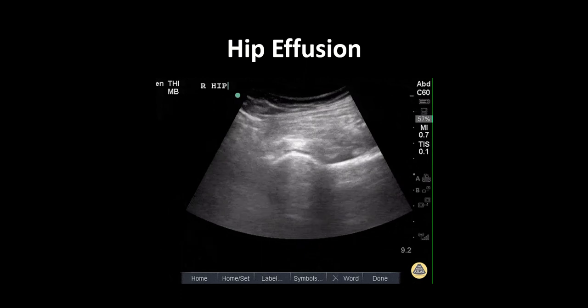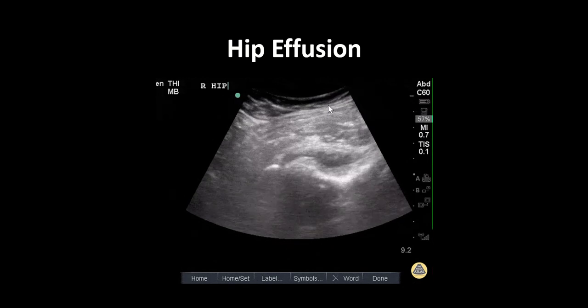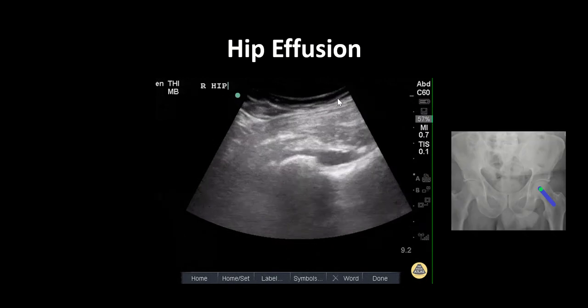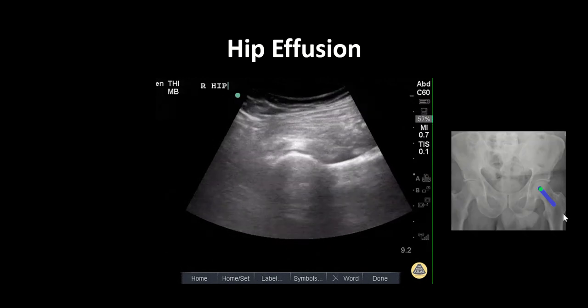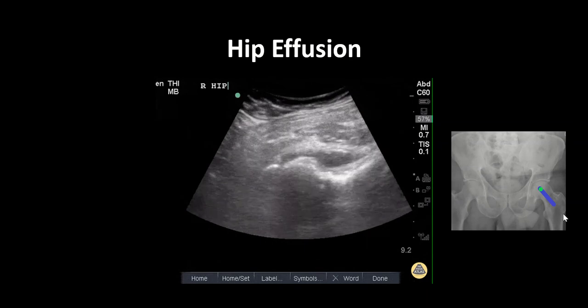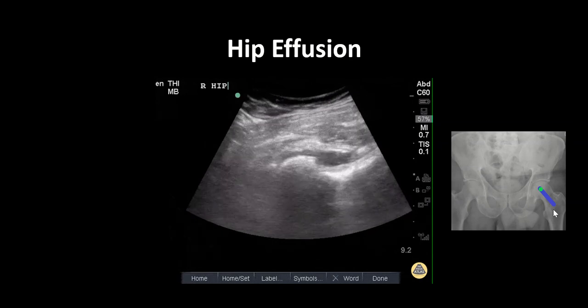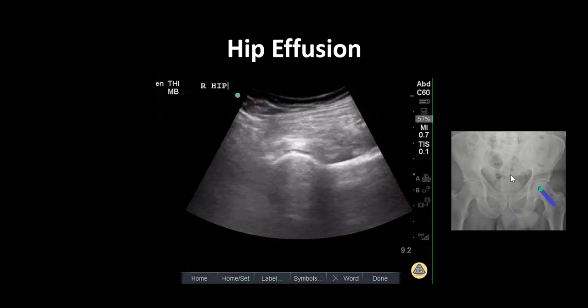In this clip, a curvilinear probe is used, as delineated by the footprint at the top of the screen. Using the greater trochanter as a landmark, the probe is placed at the level of the inguinal ligament with the probe marker oriented towards the umbilicus.